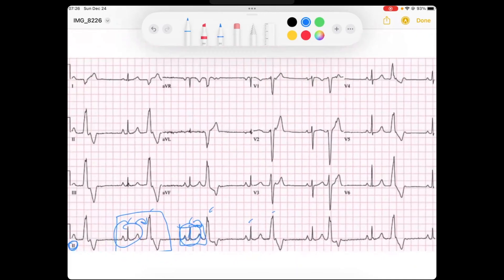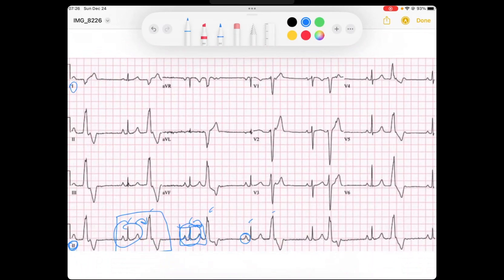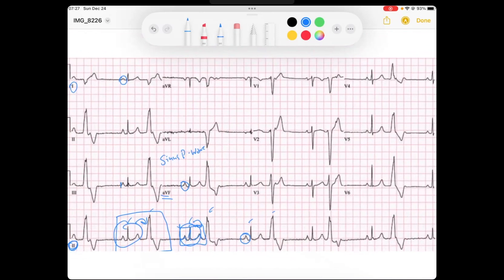On our rhythm strip, there is a nice P wave. That P wave, if I go up to lead one, is up in lead one. And the P wave in AVF on our normal beats is up. So I know that these P waves are sinus. The PR intervals on those normal beats are less than 200 milliseconds, so we do not have an AV block, and that seems consistent throughout all of the PR intervals.